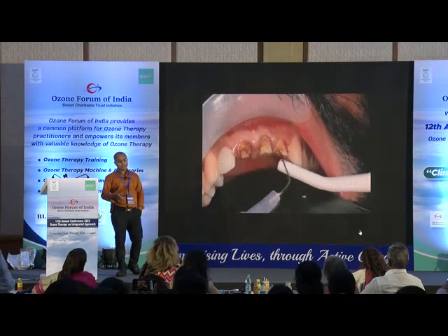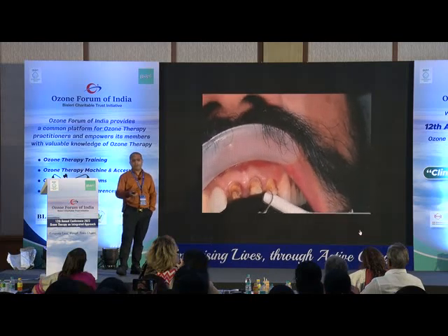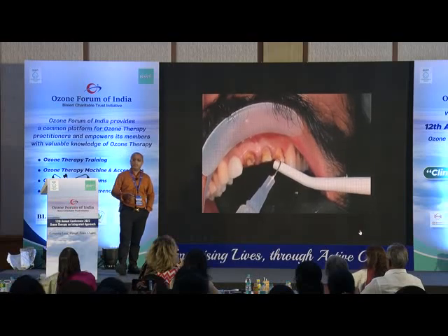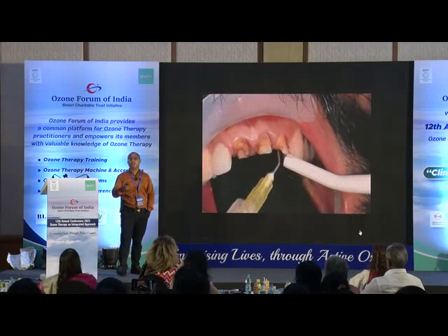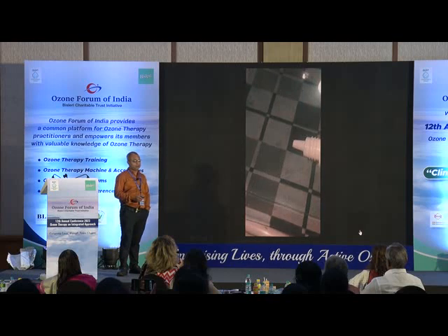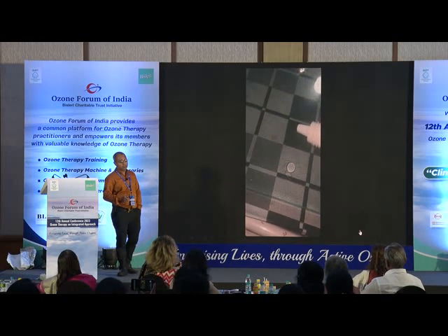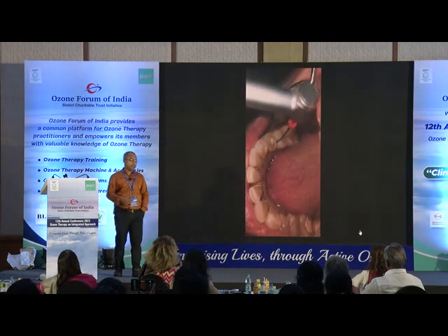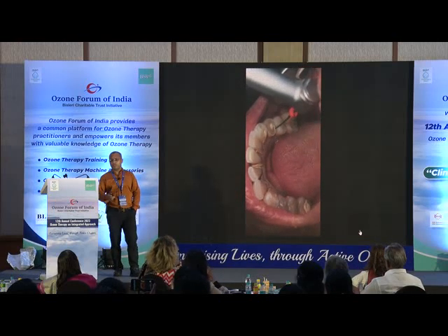But this is a video I made for a patient. This is a patient referred for re-RCT. First of all, I irrigate with ozonated saline, then give ozonated gas, then again give ozonated saline and pack it with ozonated oil. This really heals the socket, the pathology, very easily. So this is the oil. My colleague who uses ozonated oil as a lubricant for files made a video for me because I don't do root canals now.